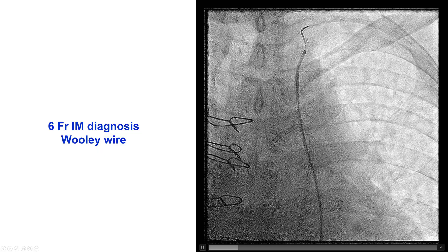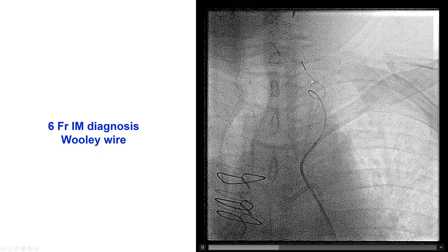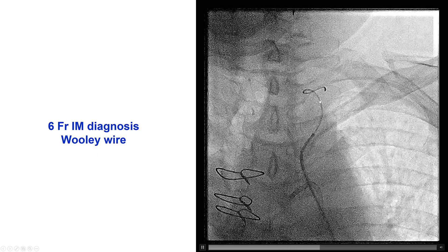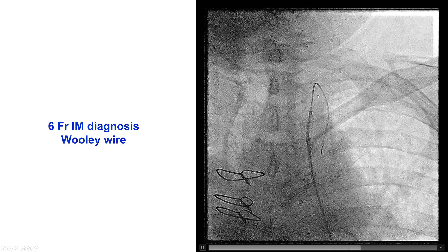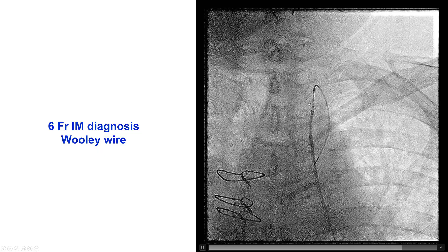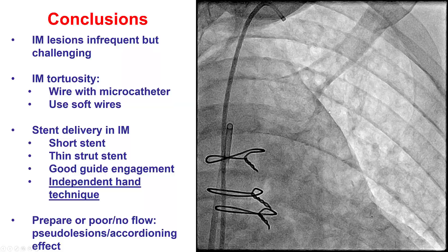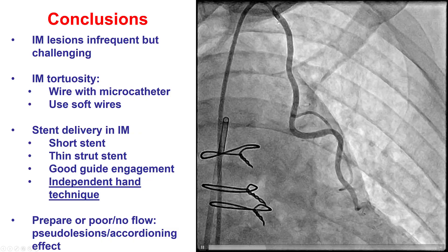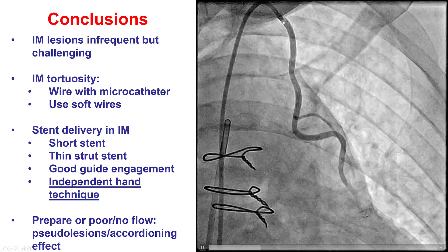We had some dampening at pressure, so we removed the 7 French IMA guide catheter and went back with the 6 French IMA diagnostic catheter. We had difficulty actually getting in, and you can see here the wire actually went into the LIMA. When that happens, you don't want to remove it — you just want to leave it there and use it as a rail to advance the catheter. And this is what eventually happened. We need to check the proximal portion of the LIMA in case there is some ostial dissection, but there was none.